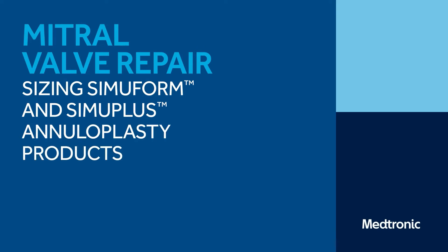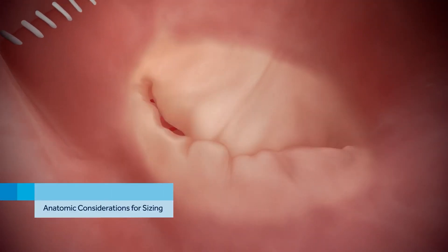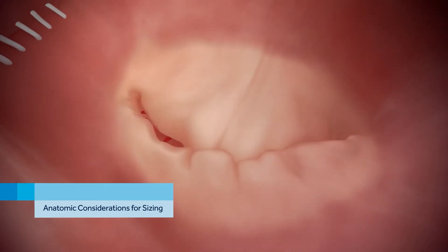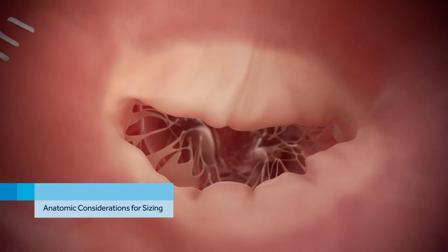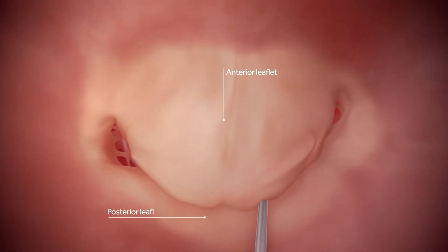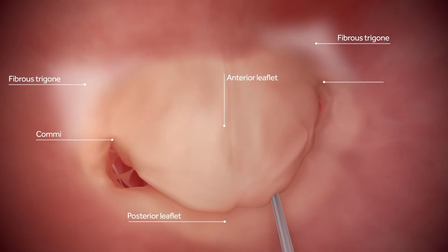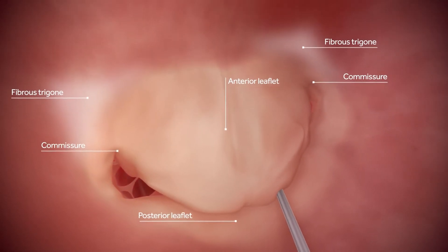Mitral valve repair: sizing SimuForm and SimuPlus annuloplasty products. Medtronic SimuForm and SimuPlus rings are sized according to intertrigonal distance. To begin sizing, locate the anterior and posterior leaflets. The fibrous trigones are also identified for orientation with a SimuForm or SimuPlus sizer.